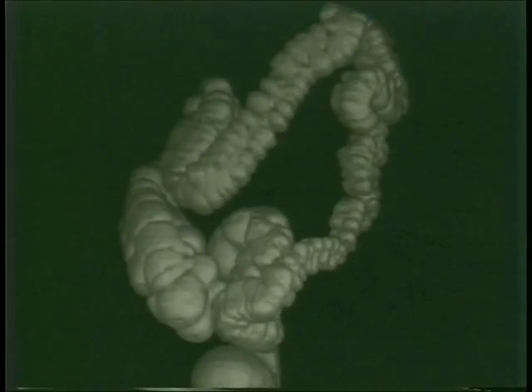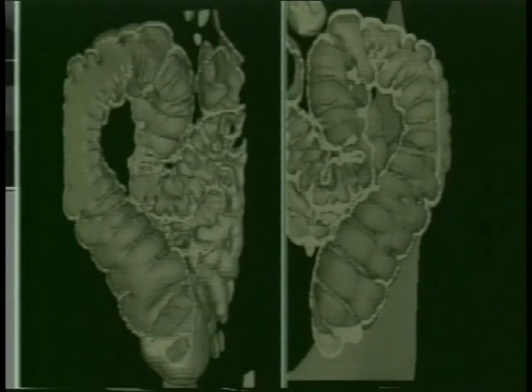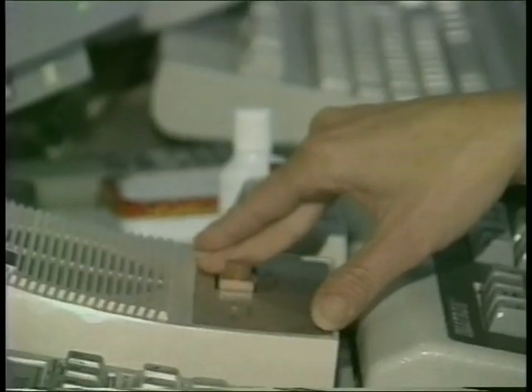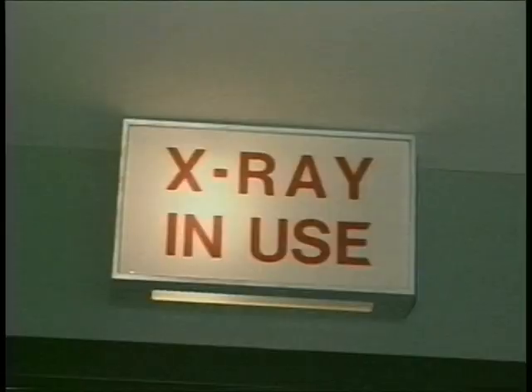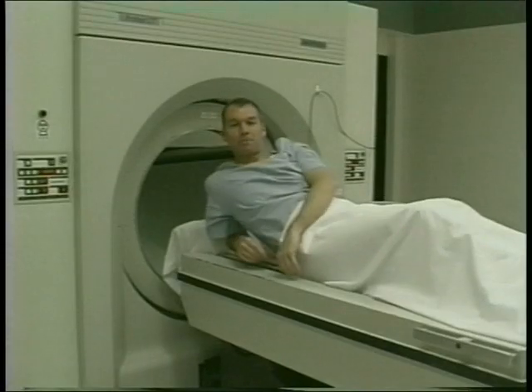As well as the main body scan, which checks vital organs like the heart, lungs and kidneys, I opted to have what they call a virtual colonoscopy. Unlike other methods of checking for colon cancer, there are no tubes inserted into the body and you remain fully awake. And blow it out. Take another breath and hold it in. Just like an X-ray, the scan involves small amounts of radiation, but the procedure itself is relaxing. It took about 15 minutes.